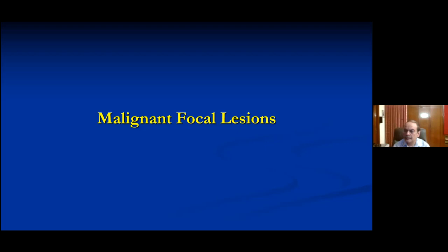So next one is from Pierre Ratna from Sri Lanka, and he's asked, what is the best imaging for a liver hemangioma? In the ideal world, definitely an MR, a contrast-enhanced MR is the ideal tool which can diagnose with a lot of diagnostic confidence. But if you don't have access to MR or cost considerations are there, a multi-phase CT is the next best substitute.